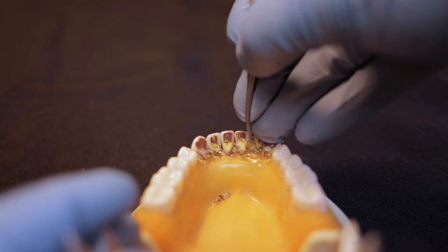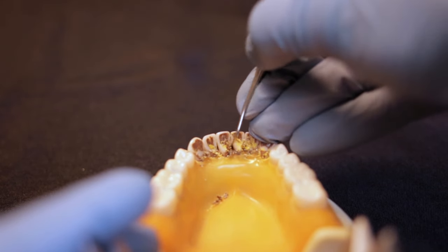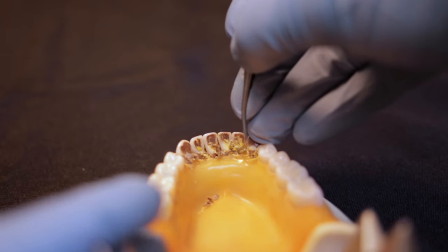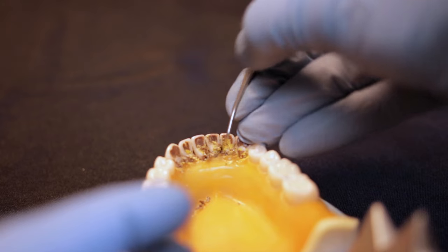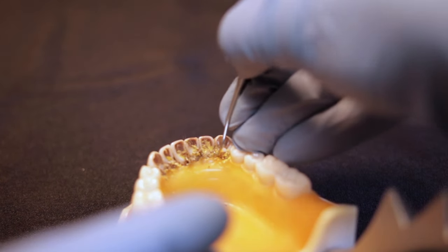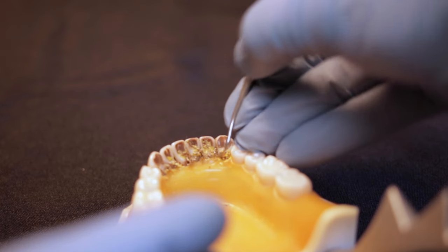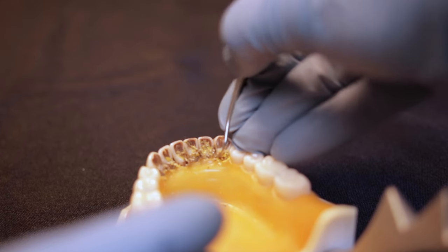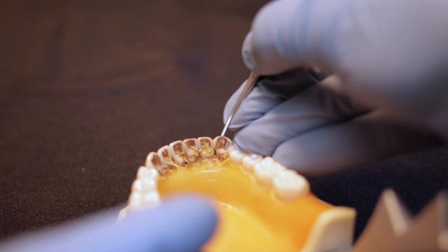We have that 70 to 80 degree angle, so you can see I'm leaned over just slightly. Sometimes your teeth are going to be really tight together and if you can't get up right underneath that contact because the instrument is so thick, try to straighten out your instrument so it's a little more parallel — then it will fit right under that contact nicely. Rock on your fulcrum when you're going through and scaling.